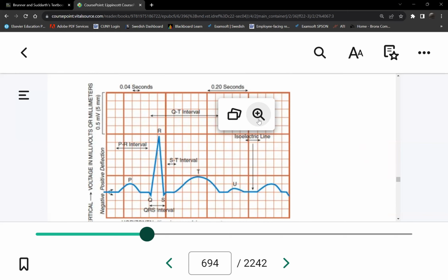I was just going to add, the ST segment on the top is an MI as well, but it's ST elevation MI, the severe type of MI. The one on the bottom is not as severe. So the one on the top is life threatening? Yes, so the ST elevation here.